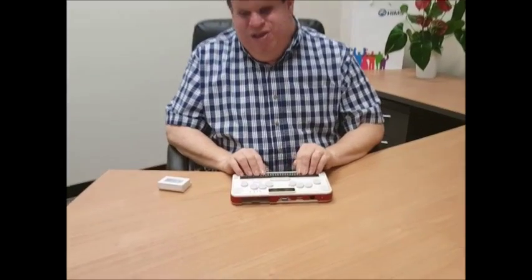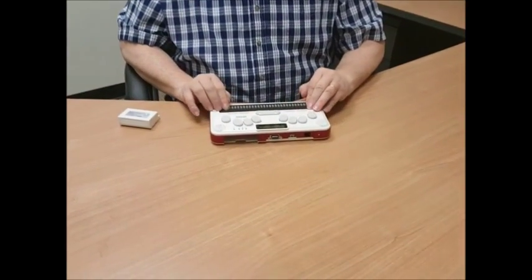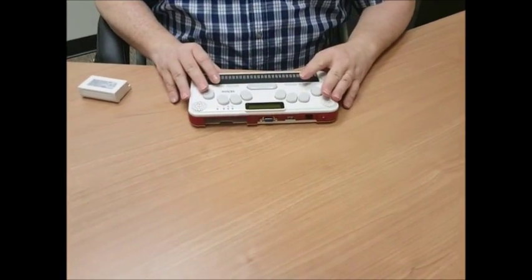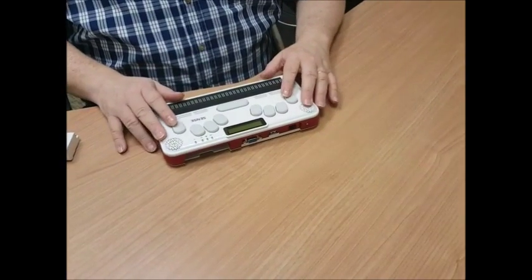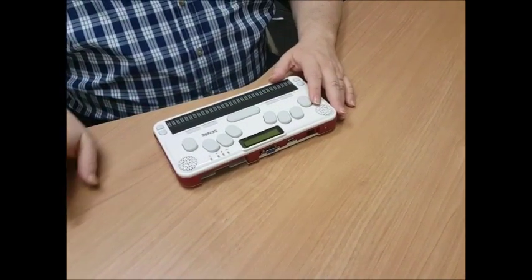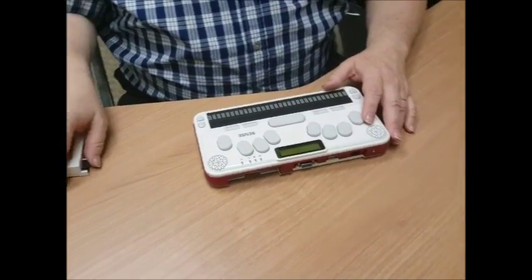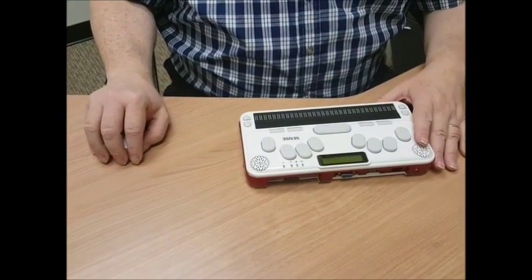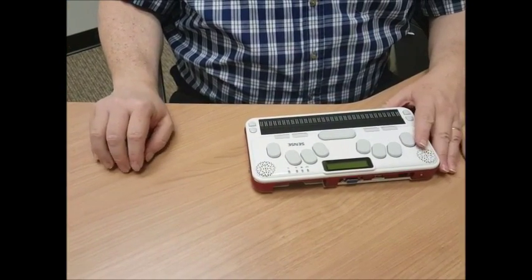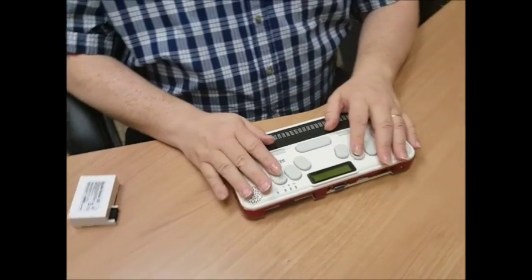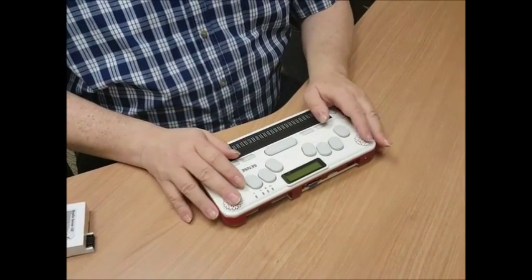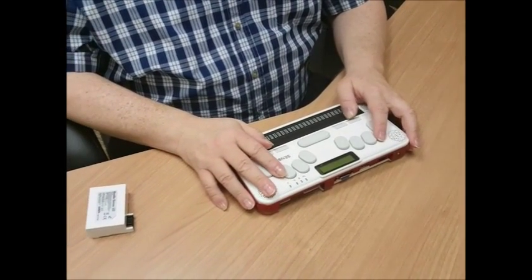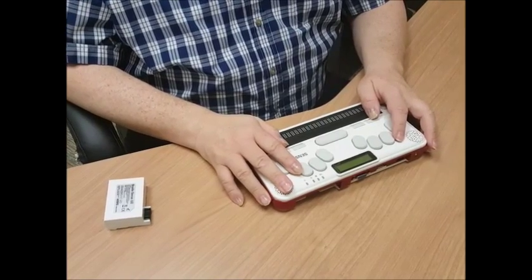So I have it oriented so that the Braille display is closest to me. This will be the normal way that this unit would be used. Right now to the right of that unit, if you can see it in the picture, is the battery and we're going to put that battery in in just a moment. But before we do that we're going to just do a quick review of what we have here on the BrailleSense.